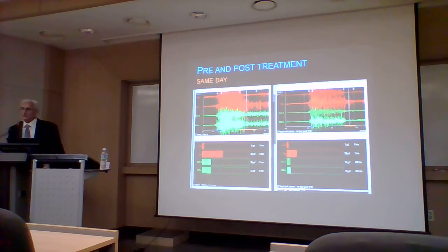So you can see we're talking about things in the occlusion that are very different than what you might have heard before. Fractions of seconds that matter, parameters on computer screens that matter, measurable force differences and timing differences that matter, not we should have bilateral simultaneous contacts and all teeth should hit at the same time. That's like a gross oversimplification of what the occlusion can really be when you use these technologies and how precise it has to be in order to make it work physiologically for someone.